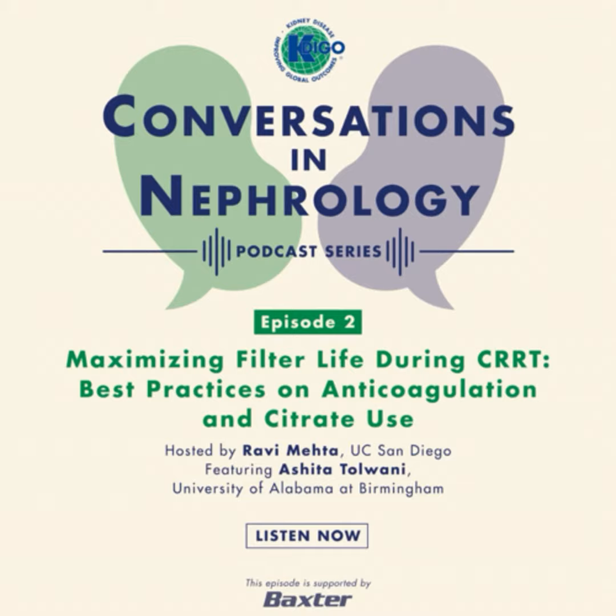Citrate solutions can be classified as either hypertonic, they have a high level of sodium and they're concentrated, or basically physiological solutions that have a normal concentration of sodium. The hypertonic solutions are administered as a separate citrate solution and is distinct from the replacement or dialysate solutions, while the isotonic solutions with a physiological sodium content are dilute and are used as an anticoagulant in a pre-dilution replacement fluid.